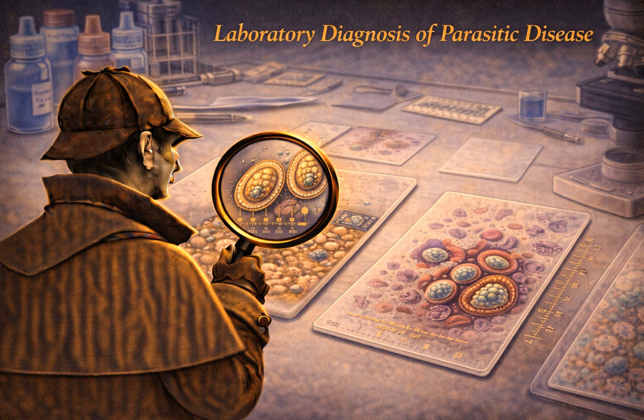If you know exactly where the parasite is, in the gut lumen, the bowel wall, or the blood, and if you know when it is there, night versus day, then you can logically choose the right test. If you ignore the underlying biology, you will miss the diagnosis.